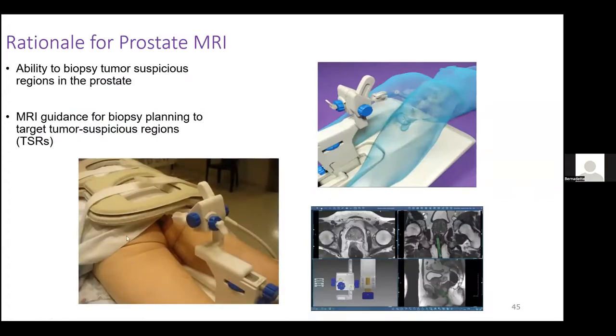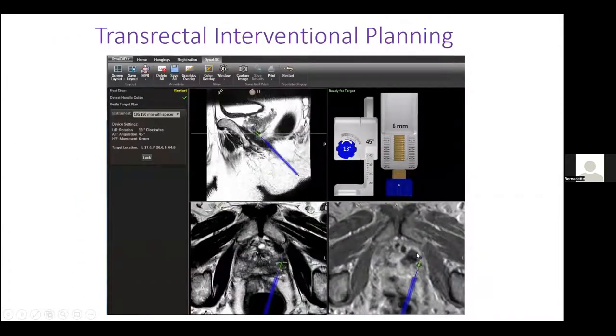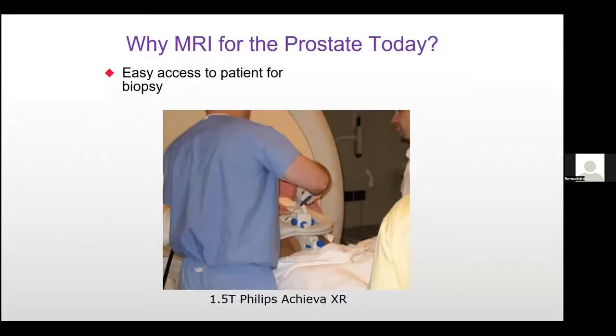So what does it look like for the man? He lays on the MRI table. There's a coil or antenna that's in a padded device wrapped around him, or one under him and one on top of him. There are different configurations. Then a little needle guide is put into the rectum and mounted to a little stand that allows us to angle left, right, front, back, and insert and retract in the head foot direction. So here we're able to use software to plan the trajectory of the device that we're inserting so that we aim precisely at what it is we're going after. And here's a picture of our friendly neighborhood urologist doing a targeted biopsy.